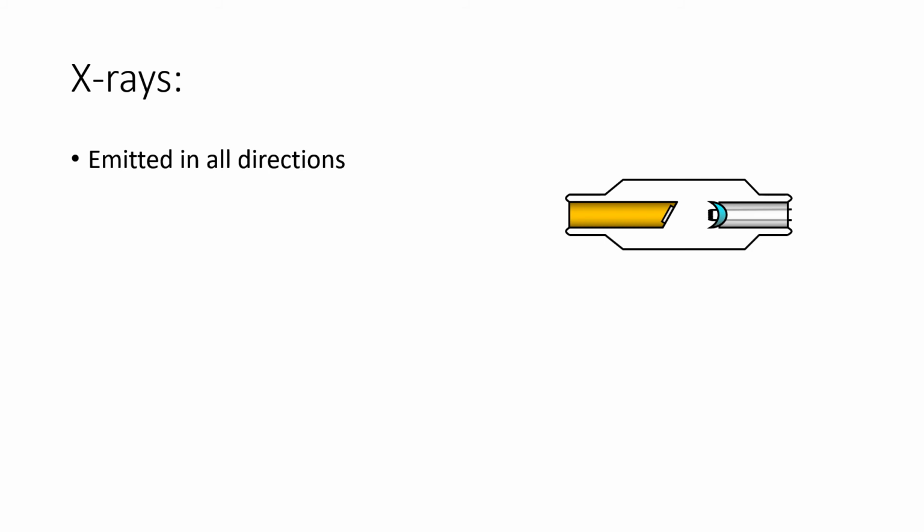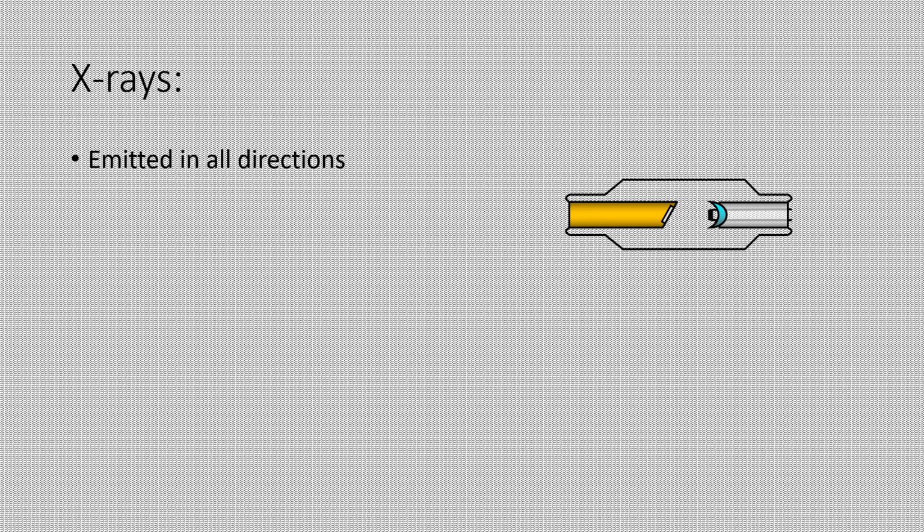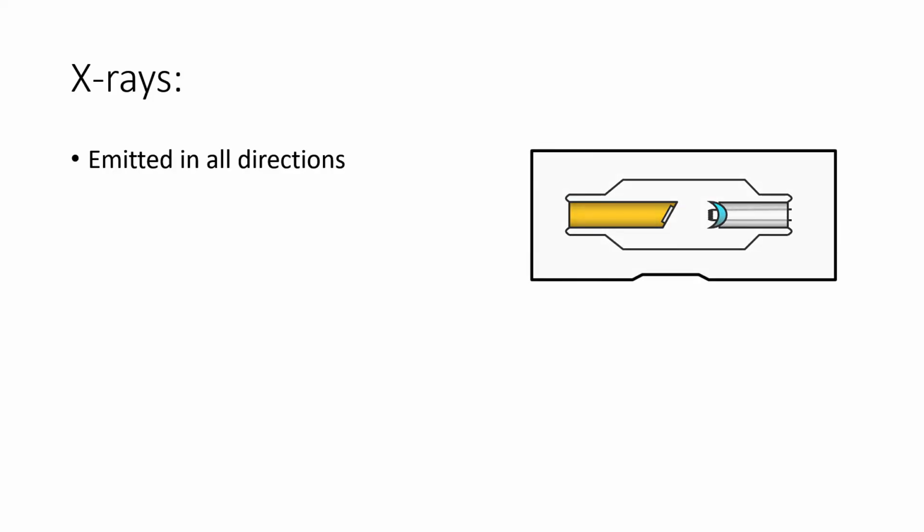X-rays are emitted by the focal spot and travel in all directions. This unshielded X-ray tube literally fills the room with primary radiation. If we add a lead housing to the tube, things become more orderly and the radiation will be confined. When the X-ray tube is fired again, the radiation is confined by the housing. A divergent cone of radiation is allowed to escape via the tube port.